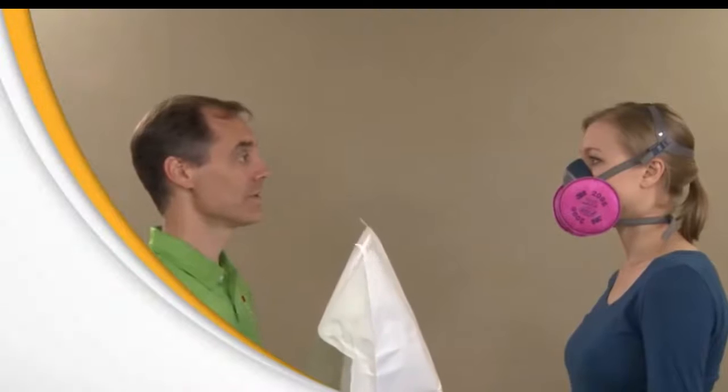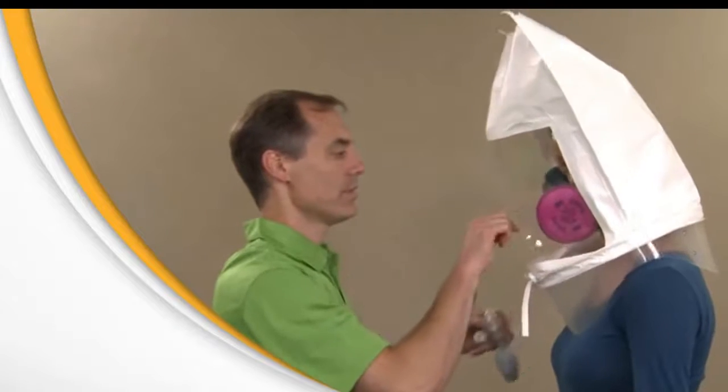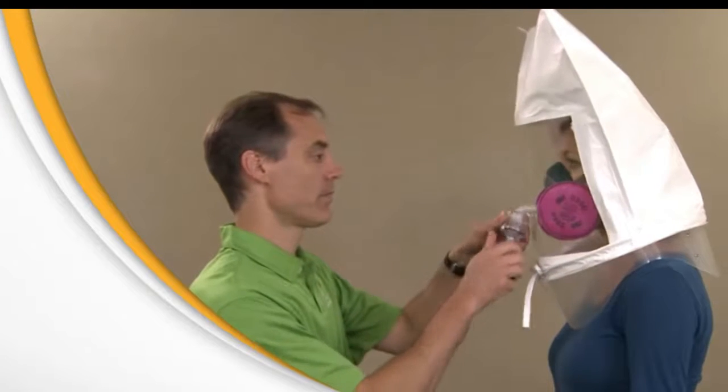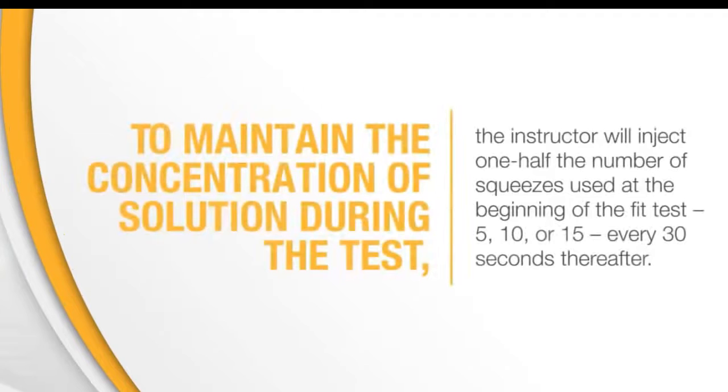The instructor will place the test hood over your head again and position it so you have about 6 inches between your face and the window. Now, using nebulizer number 2, the instructor will spray the fit test agent into the hood, using 10, 20, or 30 squeezes, depending on the number of squeezes needed to taste the test agent. To maintain the concentration of solution during the test, the instructor will inject half the number of squeezes used at the beginning of the fit test, 5, 10, or 15, every 30 seconds thereafter. Continue to breathe through your mouth during the entire test.